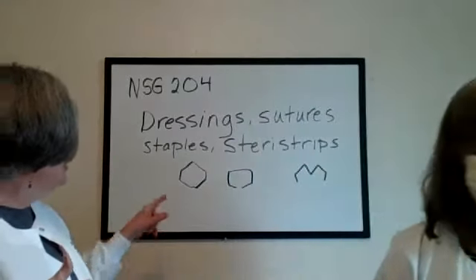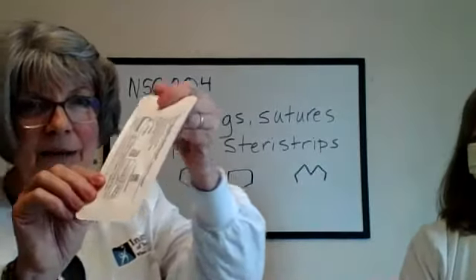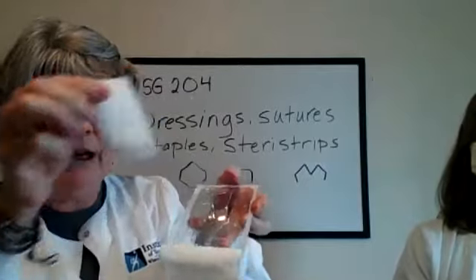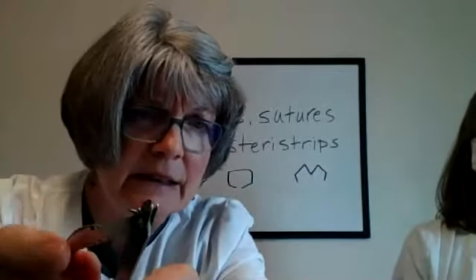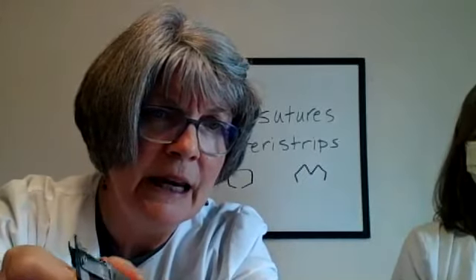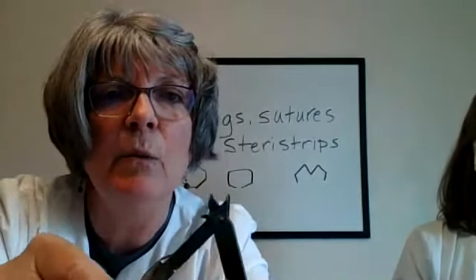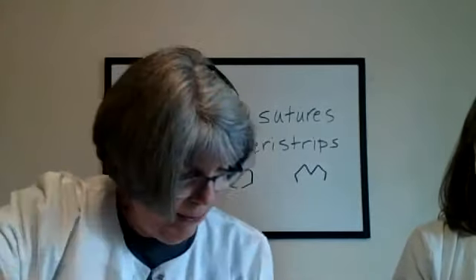Yes. So when you are asked to remove some staples, once again, we have little pre-made packages here, which is great. When you open it up, once again, we have a little gauze right here, and then we have this great little tool right here. It's kind of hard to see. There are three little prongs there. There's two on one side and then one on the other. And what this does, you go in under the staple.